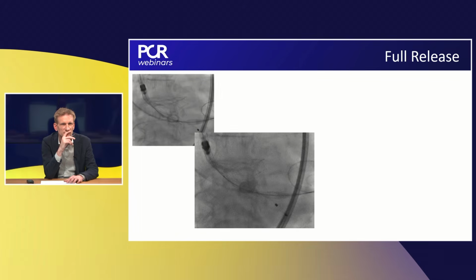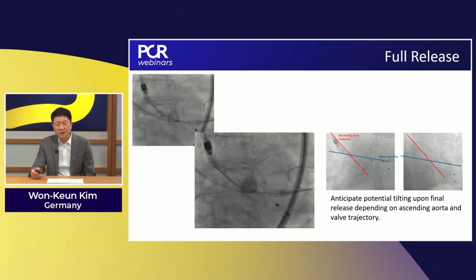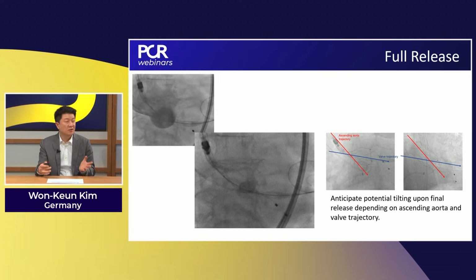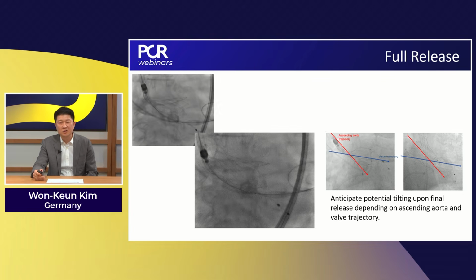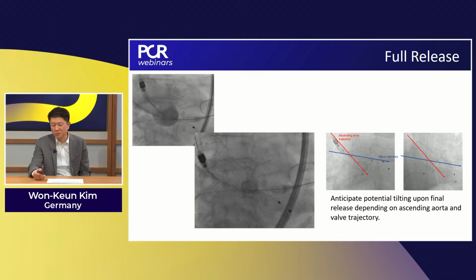Yes. On the left-hand side, you can see the position after resheathing, and in the center you see the full release. This image also highlights what you mentioned, that you should always anticipate potential tilting to one or the other side, and that this might change the implantation depth and trajectory of the valve.